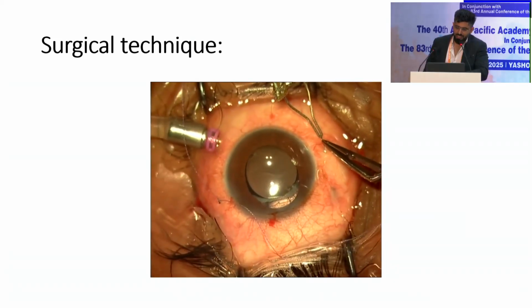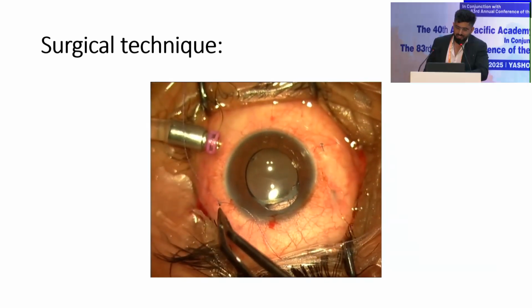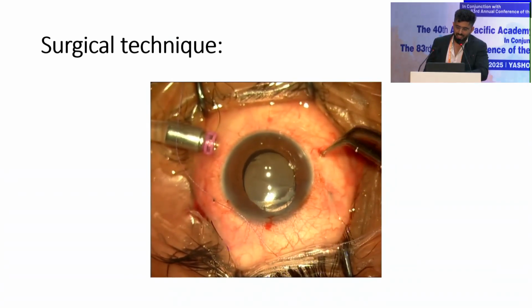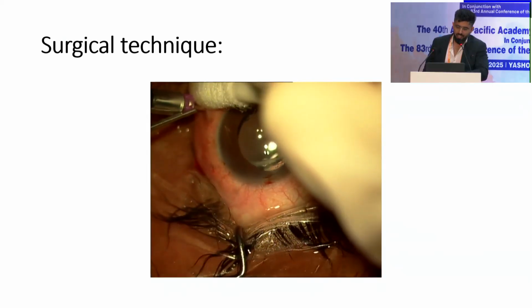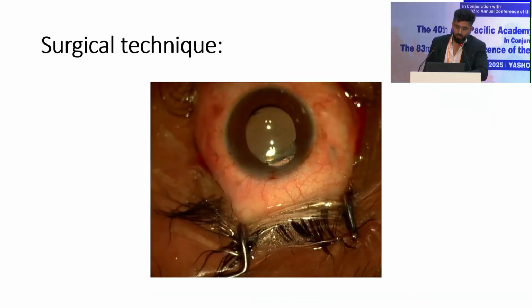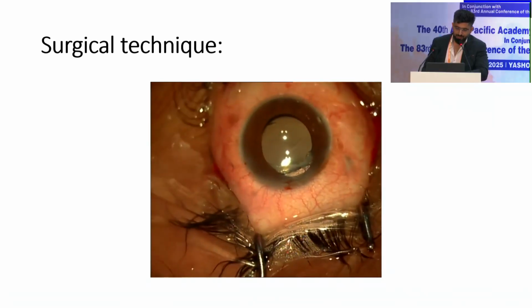A similar procedure is done on the other side. Once this is done, now the haptics are being tucked into the scleral tunnel, achieving a well-centered IOL. And the infusion is being taken out, so it is more of a sutureless, flapless, glueless technique for SFIOL.